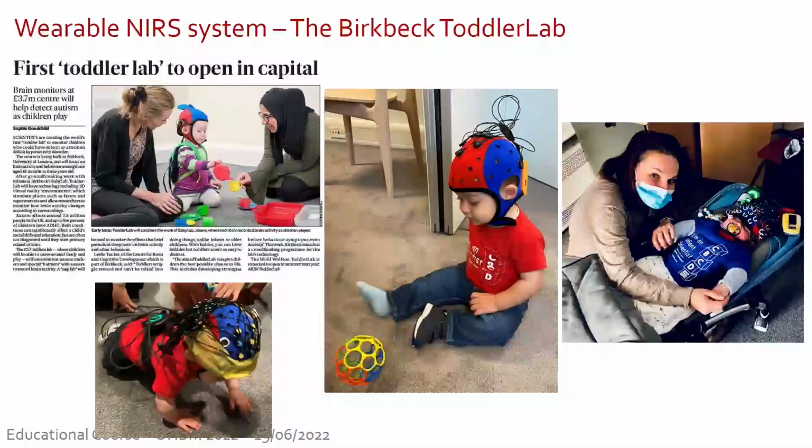And in this slide here, I also put a picture of my son taking part in a sleep study. You might say, of course, you can do that with fMRI, true. But first of all, the researcher has been able to easily implement EEG too, to account for sleep stages, which is good when you're doing connectivity studies. But also, he was able to sleep in his own buggy, which made him sleep for a solid 2 hours. And even if he was moving a little bit, that didn't create much issue in the data.